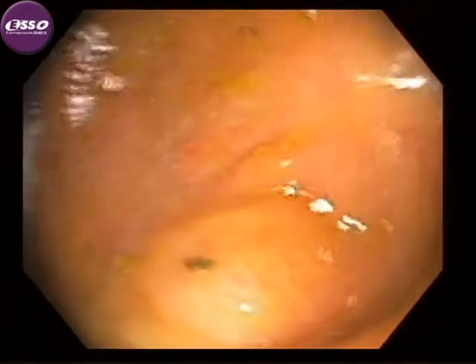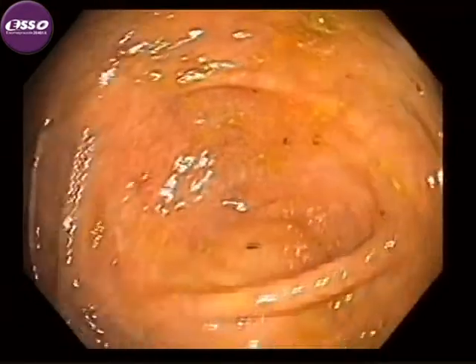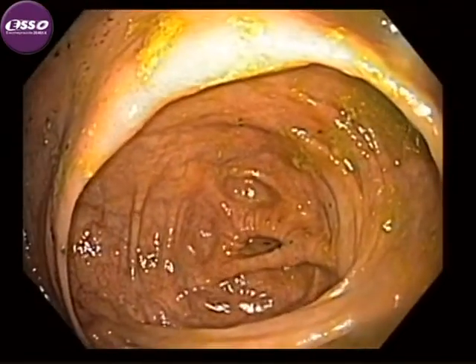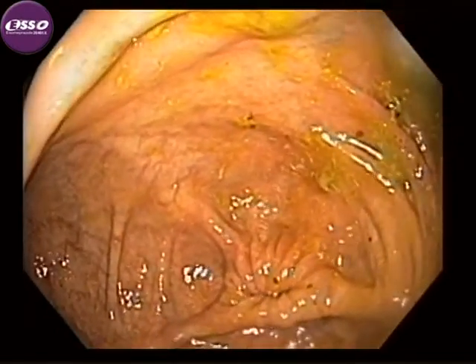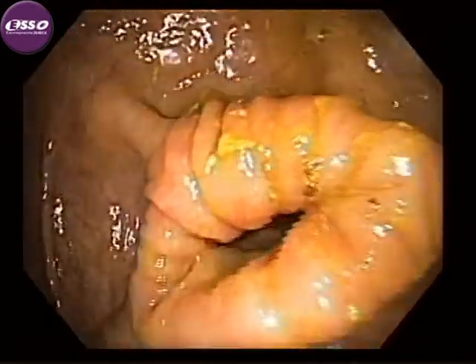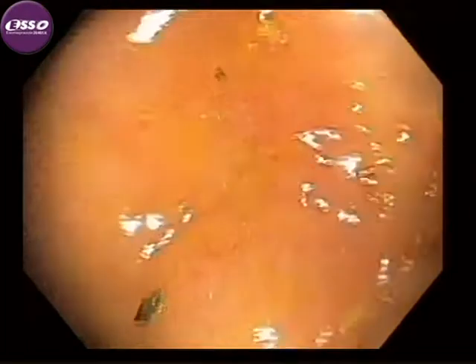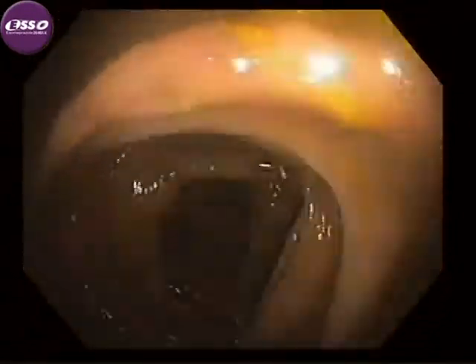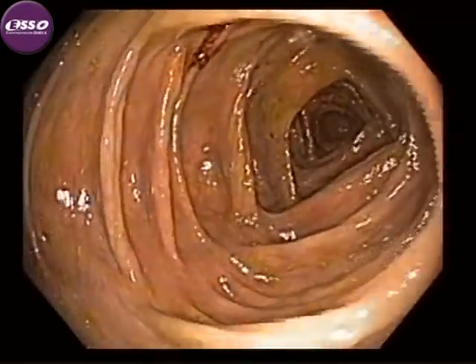The other area of the colon that we can identify with absolute certainty is the cecum, because no other area of the GI tract has the appearance of the cecum. To be certain we're in the cecum, we must see the ileocecal valve and its orifice, and we should also see the appendiceal orifice. Only occasionally is the appendiceal orifice completely obliterated by prior appendectomy. Intubation of the terminal ileum can help assist identification of the cecum, but it's not necessary for reliable identification. We can also be reasonably certain that we are in the ascending colon if the ileocecal valve is still visible to us in the endoscopic field of view.